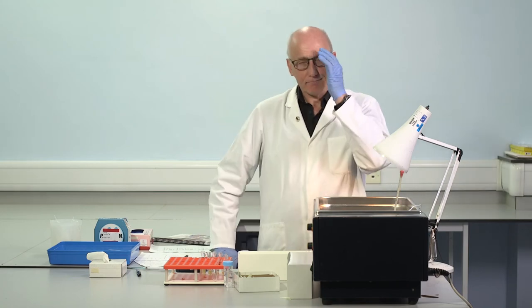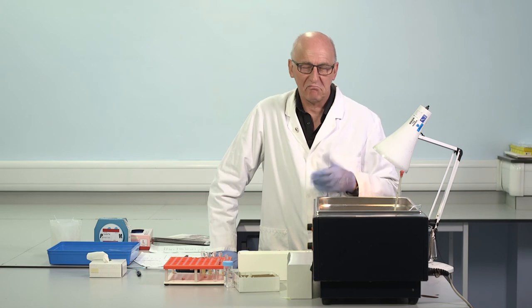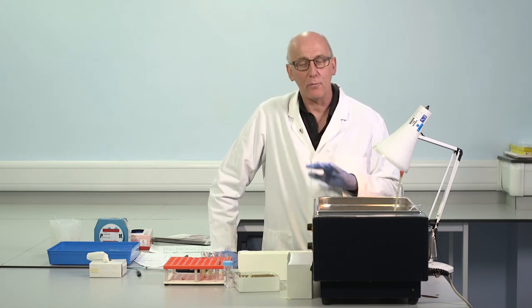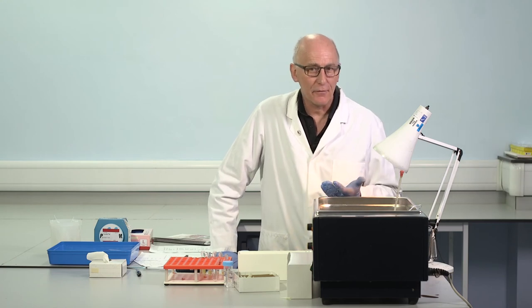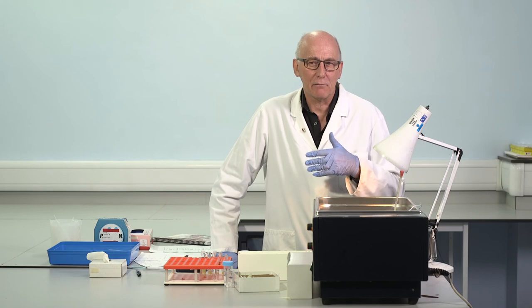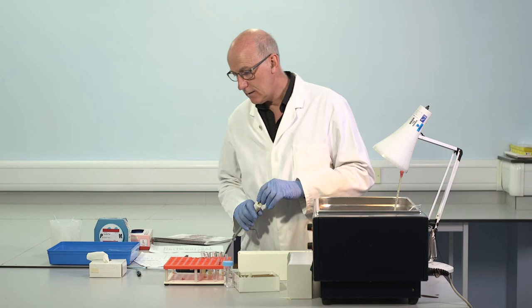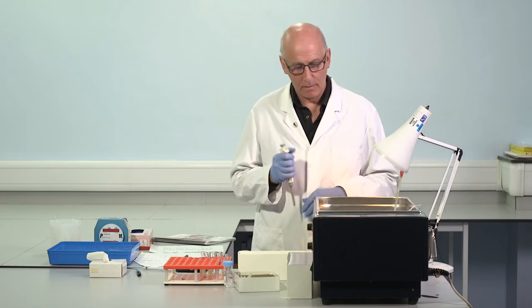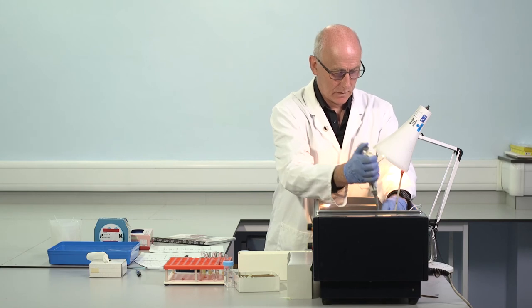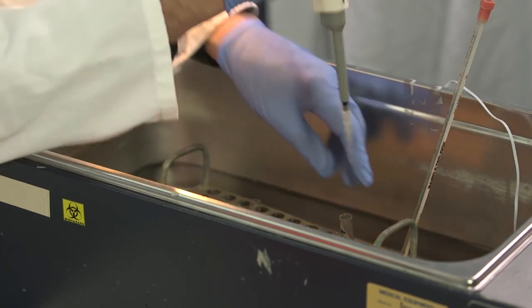Patient number 3. APTT earlier, 75.6, 76, 76 seconds. So quite a marked prolongation, upper limit of normal 39. If that's a deficiency, it's going to be quite a low level. It would be 2, 3, 4 international units per deciliter. Could, of course, be an inhibitor. Warming up to temperature. APTT reagent.